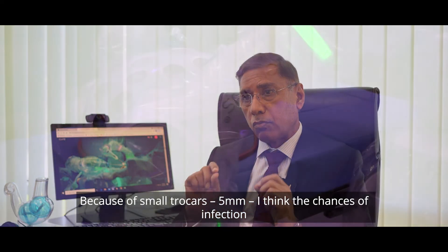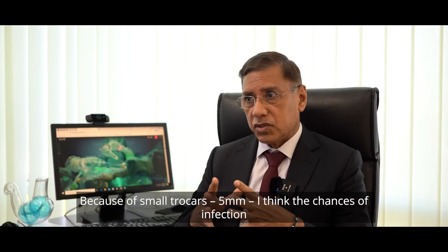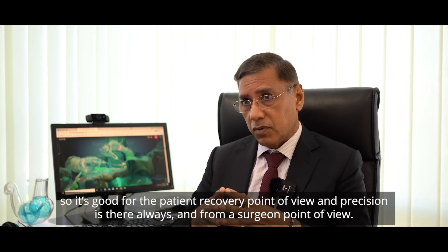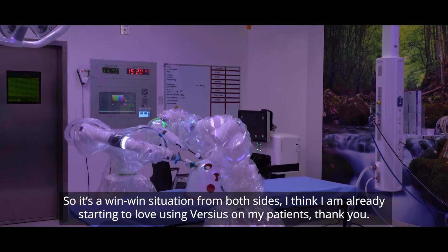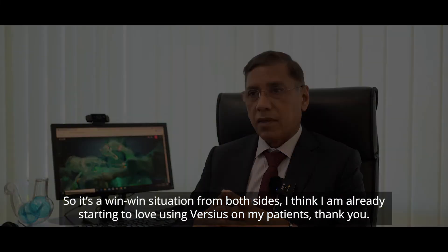And because of the small 5mm trocars, the chances of infection and port site hernias are also reduced. So it's good for the patient from a recovery point of view, and precision is always there from the surgeon's point of view — it's a win-win situation from both sides. I think I've already started loving Versius for use on my patients. Thank you.